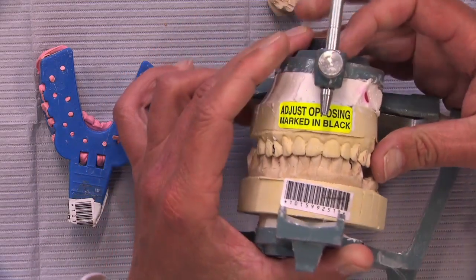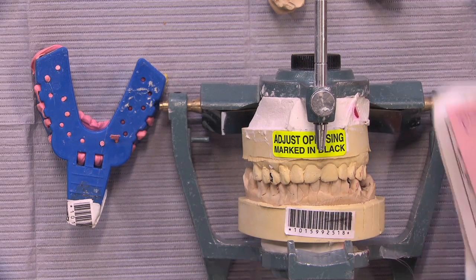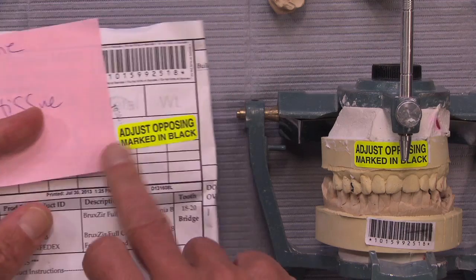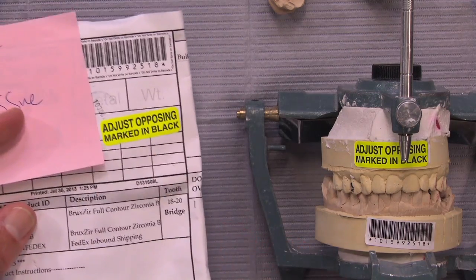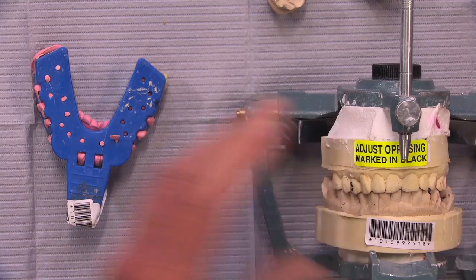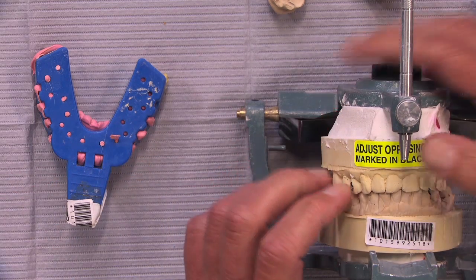So you'll notice there's a big sticker here that says adjust opposing marked in black, and it's also on the in-house lab sheet that we use, where it says adjust opposing mark in black. So everybody knows that when this ships, there has to be a sticker on the box with the BruxZir bridge in it that says adjust opposing marked in black.